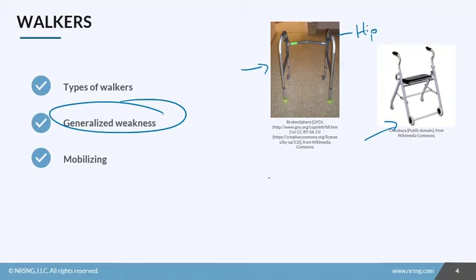When your patient goes to move, they should move the walker first about 6 inches, and then they should step with their weak or affected side. The reason you want to do that is that you're going to provide some stability through the arms, and you can move that, and the back leg, which is a strong leg, is going to offer some stabilization and balance, and then they can step forward with their strong leg. So they always move the weaker leg or the affected leg or side first.